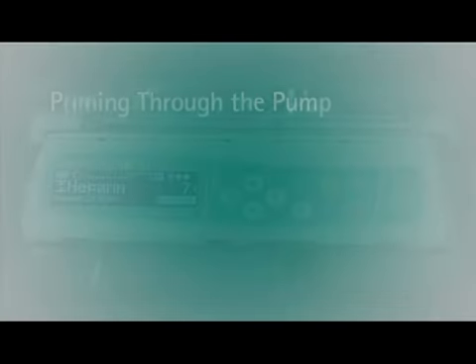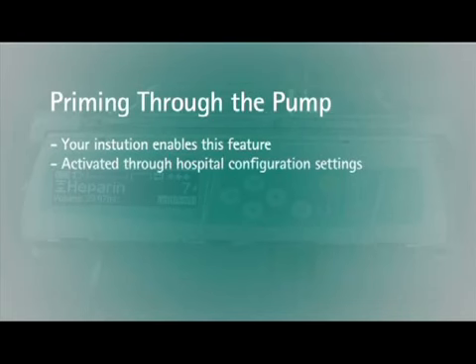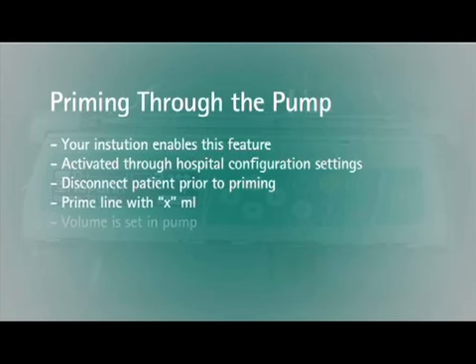Some institutions may elect to enable the optional priming feature to prime the tubing through the pump. This feature is activated through hospital configuration settings. The pump will display a brief message advising you to disconnect the patient prior to priming. The display will read Prime Line with X mils. The priming volume is set in the pump configuration. Press the up arrow for Yes to prime the prompted amount.